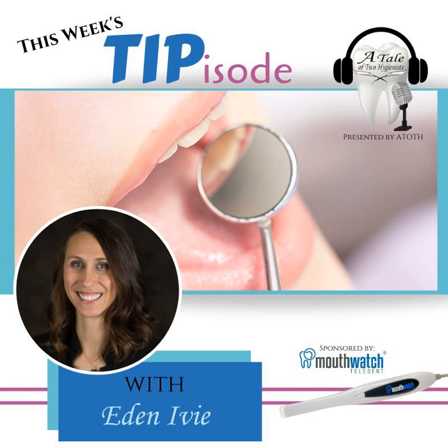I have heard some dentists say that they will often stop in the middle of treatment and take images for insurance documentation. This helps with claims. If they had to change treatment, if they had planned to do a 2-surface filling and they open it up and it really needs to be a 3-surface filling, they'll just snap a picture of that decay with the intraoral camera, and then there's no question, there's no blowback of, well, you said that I needed this treatment and then you did this, because it's documented. They can just show right away, this is why I made the decision that I made, and they've got that evidence, and it's not just their word.